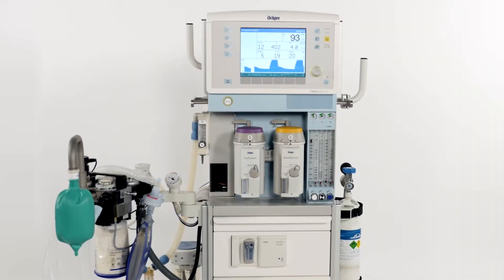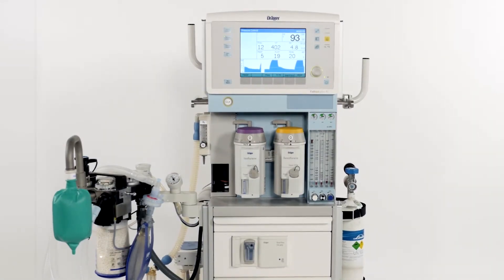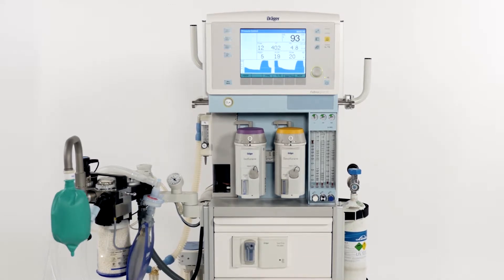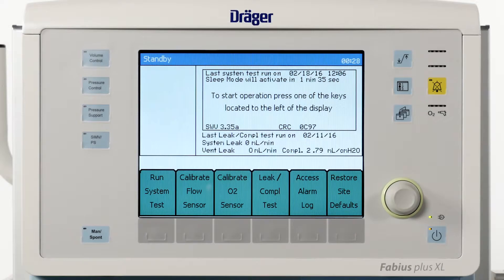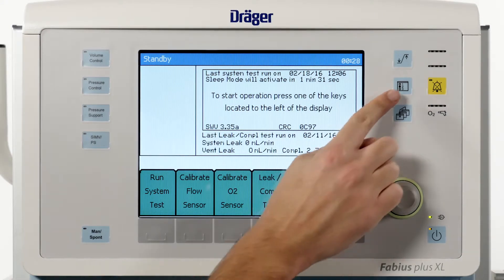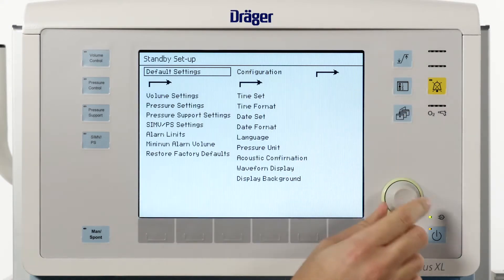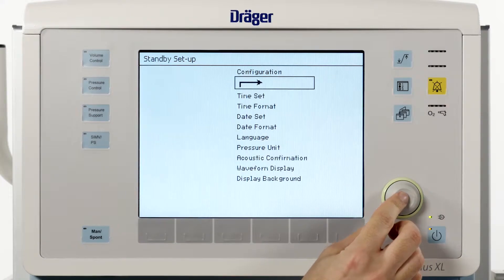In this segment we'd like to demonstrate how to configure the Fabius software according to your individual needs. To access the configuration menu, press the configuration key when in standby and choose the configuration menu using the rotary knob.